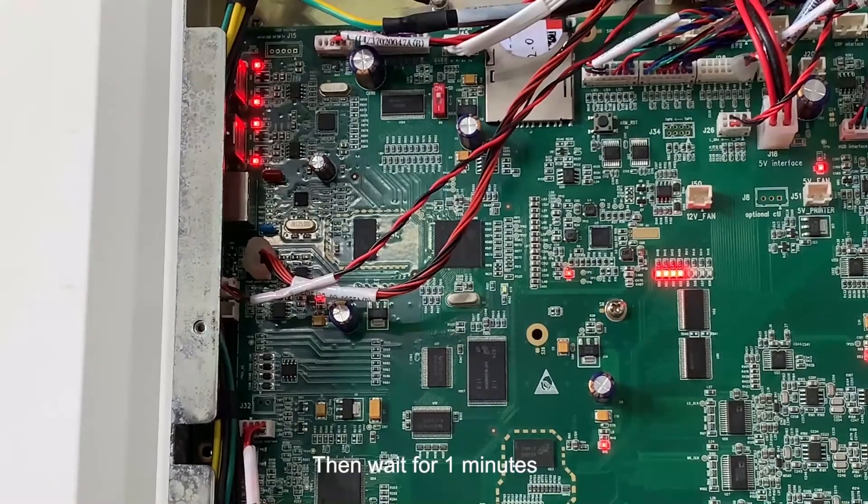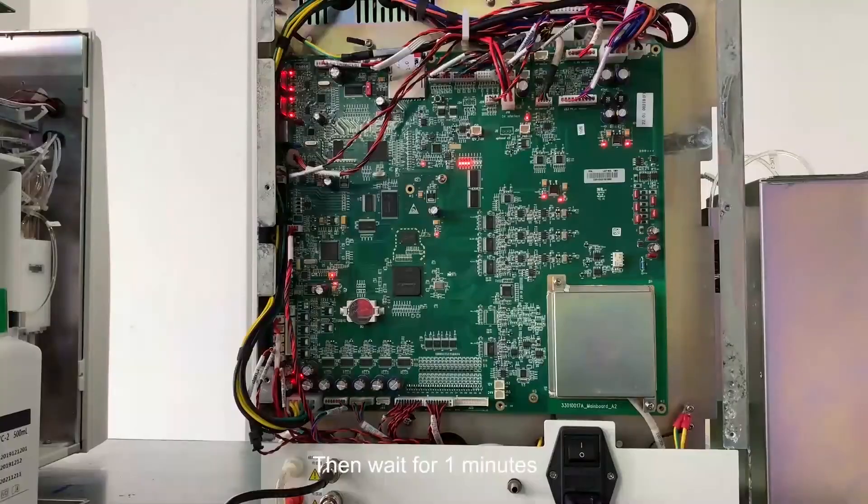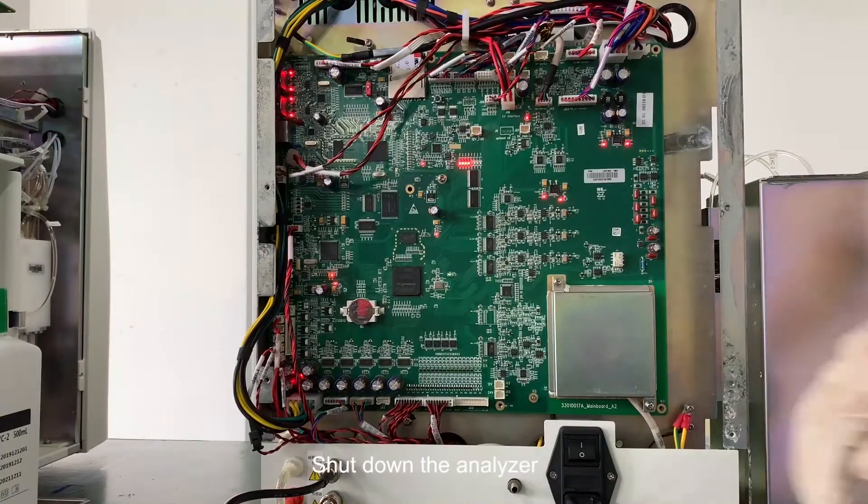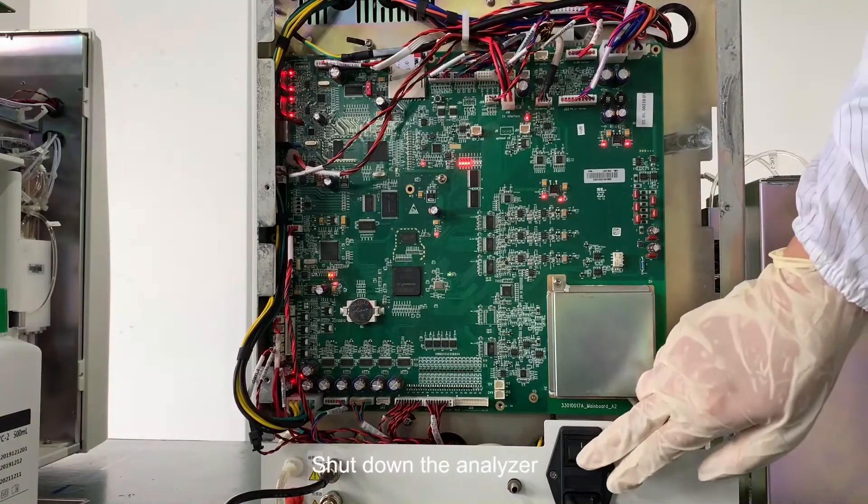Then wait for one minute. Shut down the analyzer.